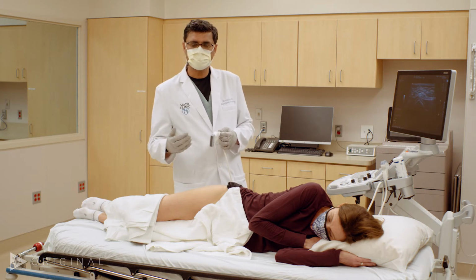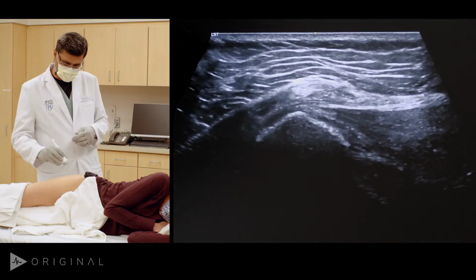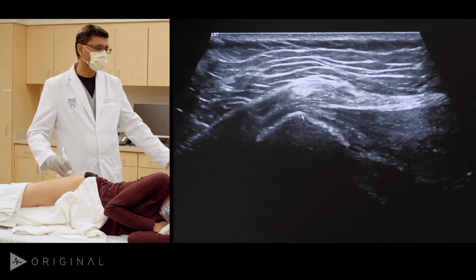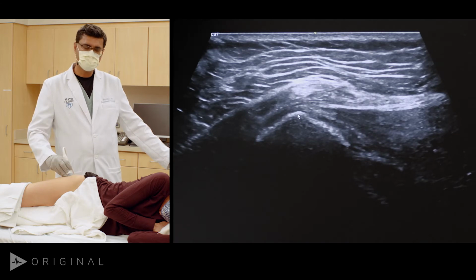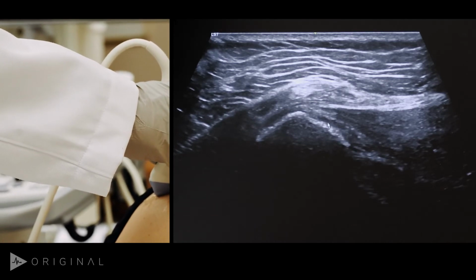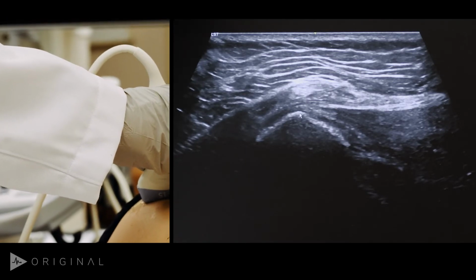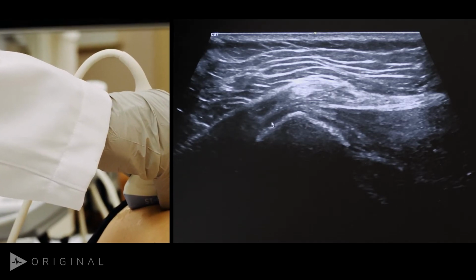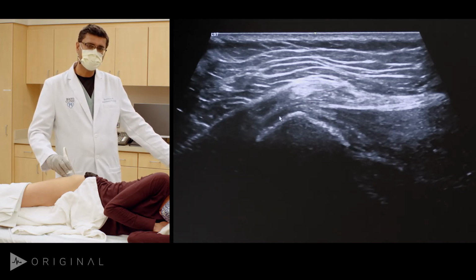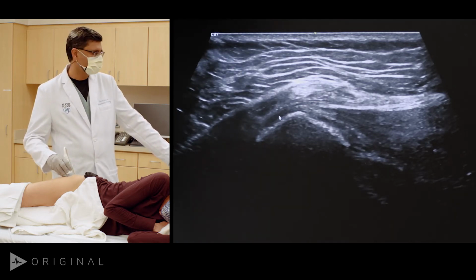So what are the two main tendons we're looking at? We're looking at the gluteus minimus and the gluteus medius. And when you do a transverse view and start out, this ridge allows you to differentiate between the two of them immediately. So you can see anteriorly, you will find some aspect of the gluteus minimus tendon, and then on the lateral facet, posterior to this prominence on the trochanter, you will find parts of the gluteus medius tendon. The gluteus medius tendon has anterior and posterior components, and it gets a little bit tricky to try and differentiate them on the ultrasound exam.